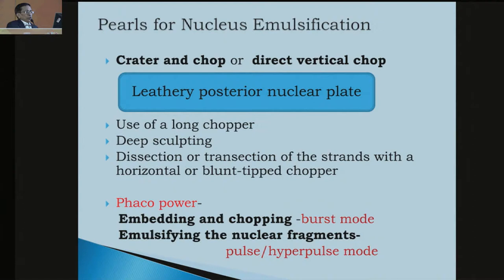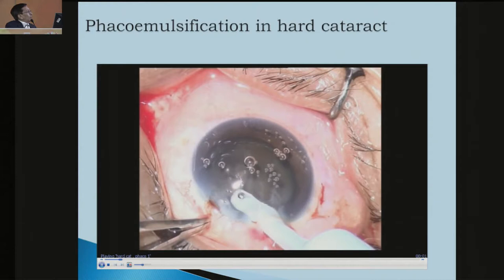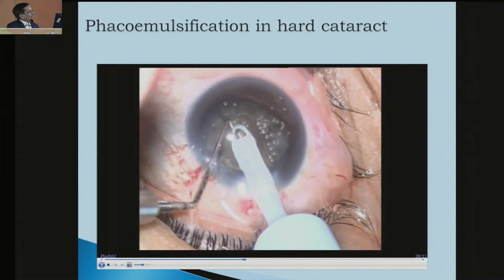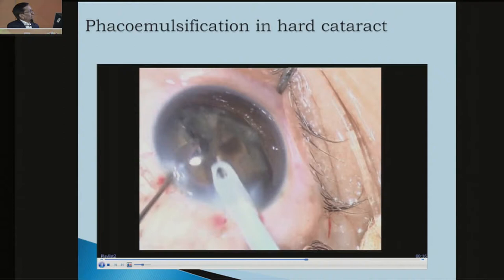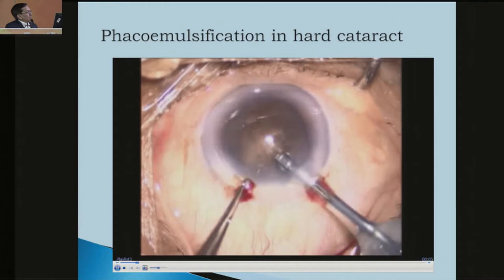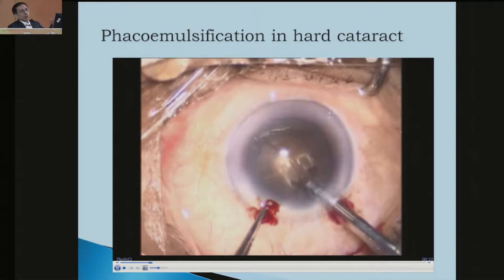Because of the leathery posterior nuclear plate, use of a long chopper is recommended. You can see in the video that you go on debulking. Push the chopper to the periphery and take it out, disengage, then engage again so you can come up to the center portion. Don't push too hard because there is resistance, so there should be higher power and slow motion so you will not injure the zonules.